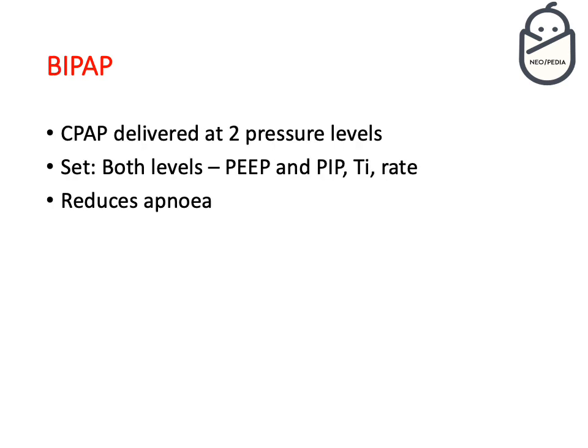The next mode of ventilation is the BiPAP. Maybe it's as simple as CPAP, to be honest. BiPAP, simply, I will explain as two CPAPs basically. It's the same machine, which usually will be able to deliver either CPAP mode or BiPAP mode. CPAP mode is just a single continuous pressure to provide continuous PEEP. But in BiPAP, it will produce the continuous pressure to maintain the PEEP, as we said previously, but it will also produce an intermittent higher pressure than the CPAP pressure.